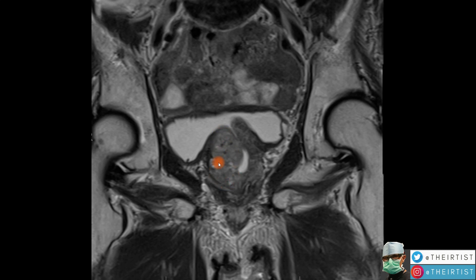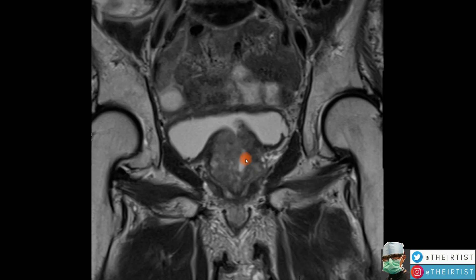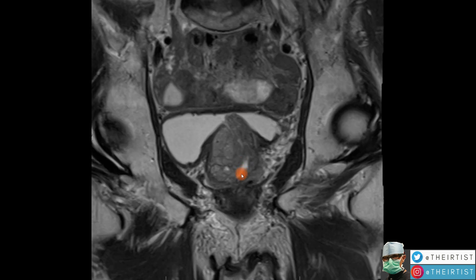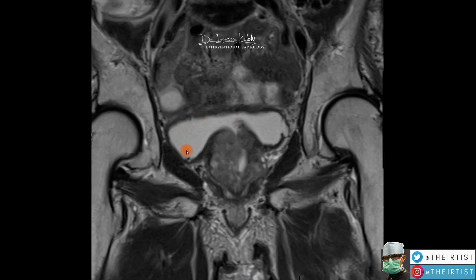We were not able to treat the right lobe because there were no visible arteries to safely deliver the particles — it remained unchanged. Both lobes were approximately the same size before, pressing together against the urethra. Now the urethra is full of urine, appearing white — a conduit has opened up, allowing urine to flow into the bladder.